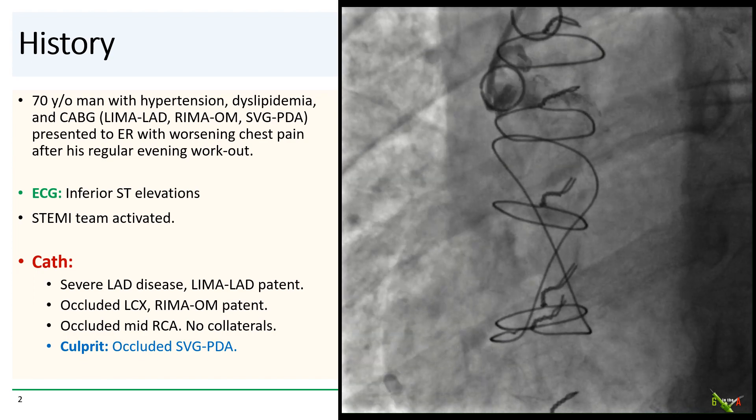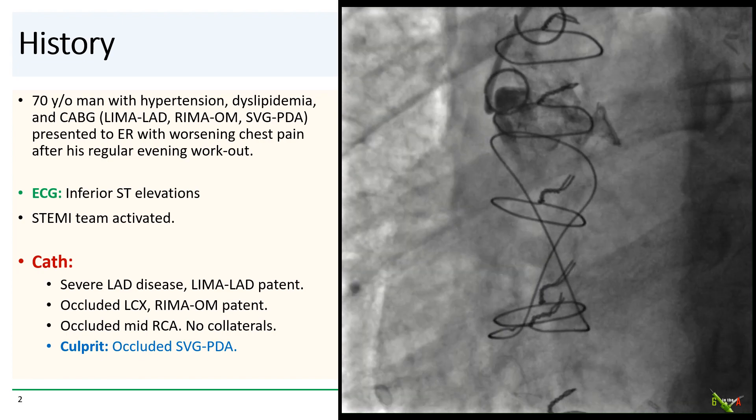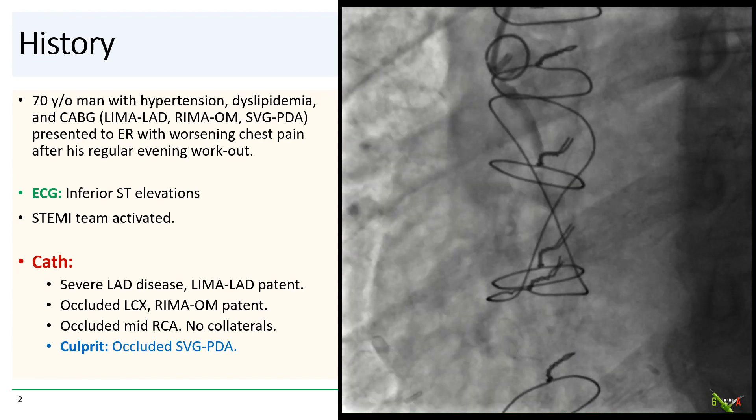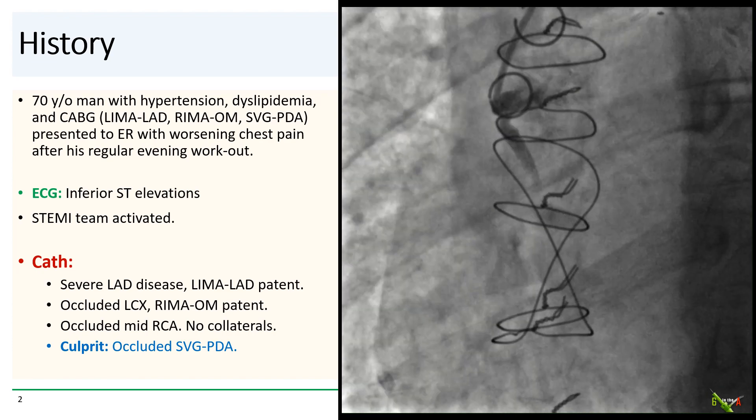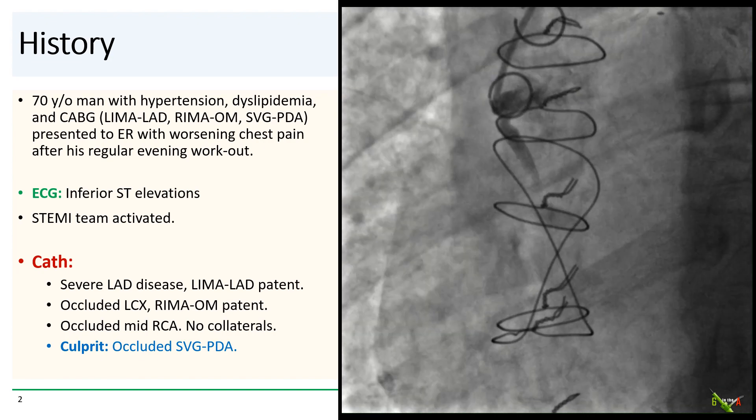On cath, he had severe LAD and circumflex disease, but both the LIMA to the LAD and the RIMA to the OM were widely patent. The native RCA was occluded, and the culprit shown here is the 100% occlusion of the vein graft to the PDA.